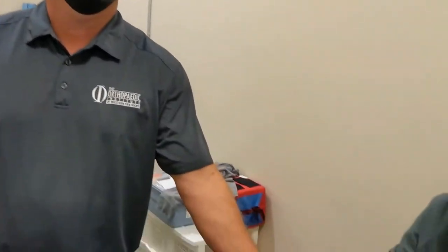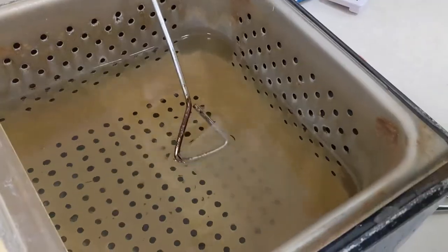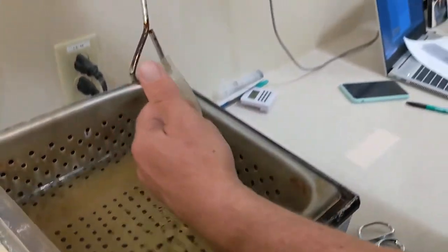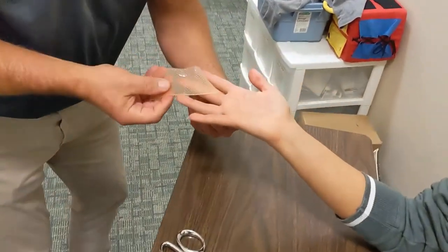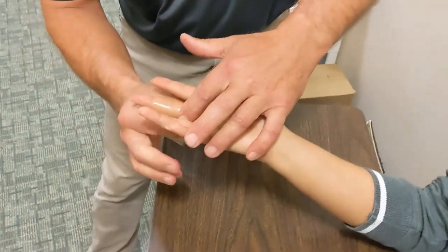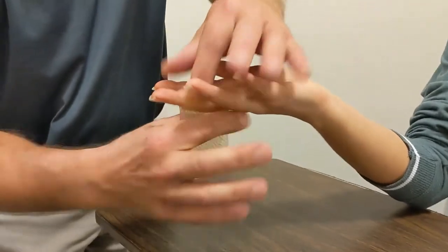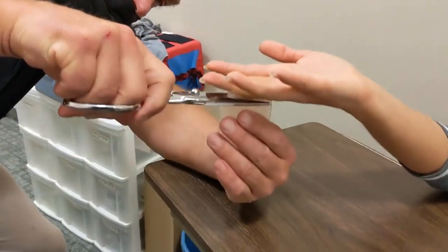The patient is going to hold her hand with her palm up like this. The material is now clear, so I'll take it out and I'll lay it over her finger. I'll cut the seam along the back.